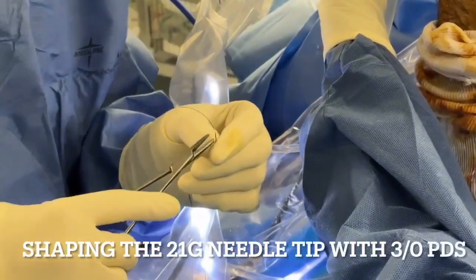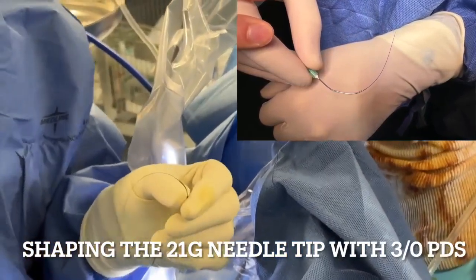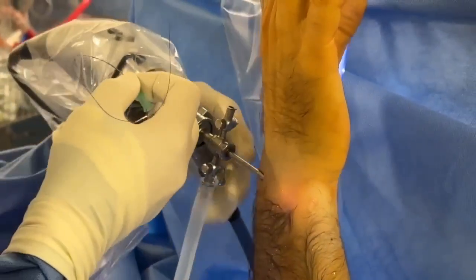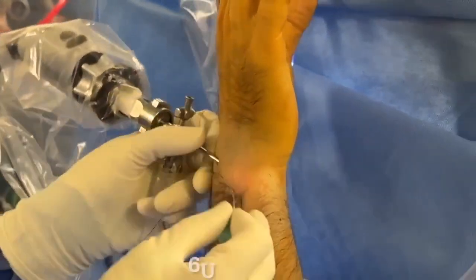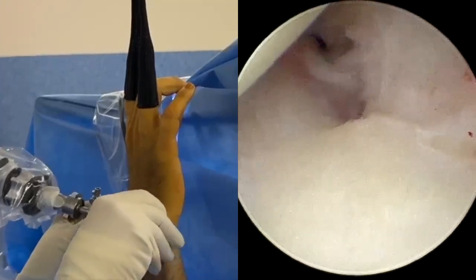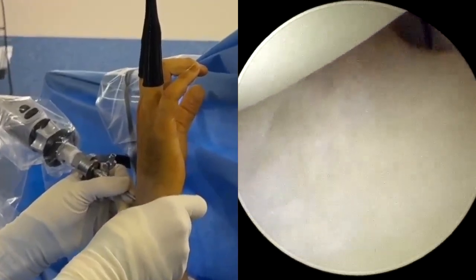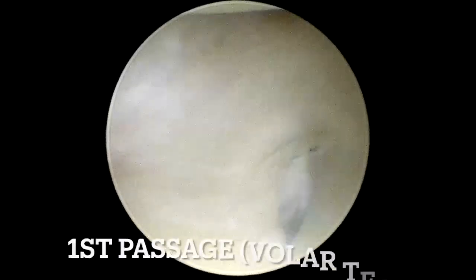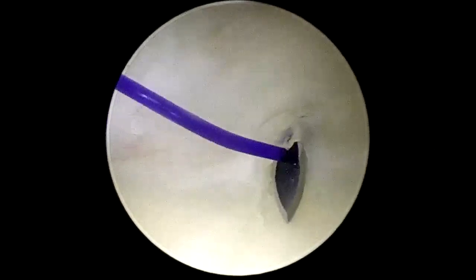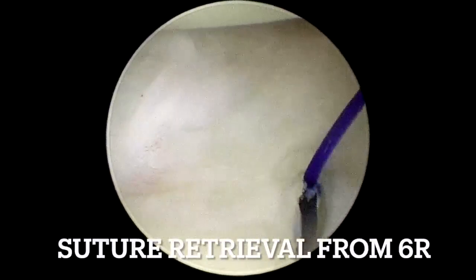A 3-O PDS suture is threaded through a 21-gauge needle and the needle tip is slightly bent to facilitate entry into the palmar TFCC from below. The needle, along with the suture, is then inserted into the 6-U portal, passing beneath the TFCC and penetrating through the palmar TFCC closer to the volar sigmoid notch. One end of the suture is retrieved from the 6-U portal.